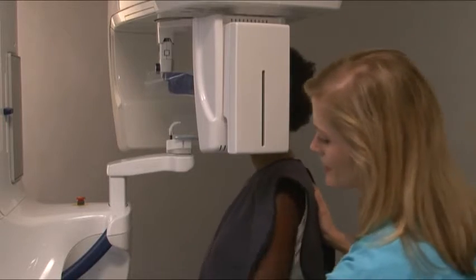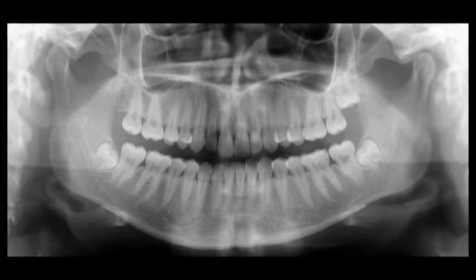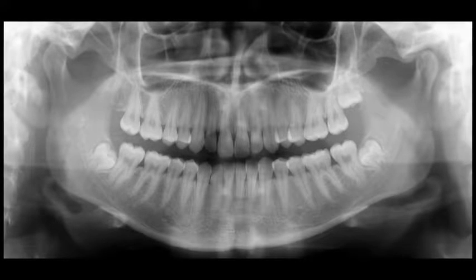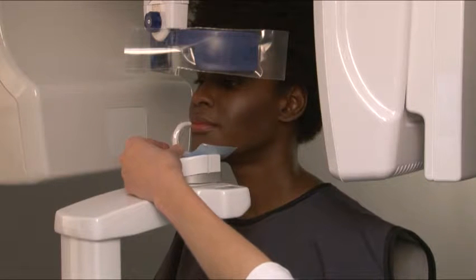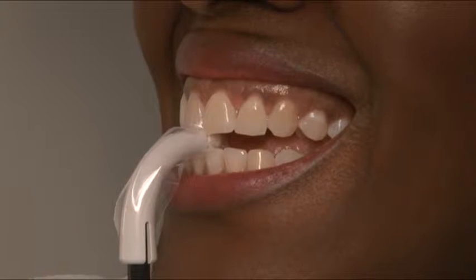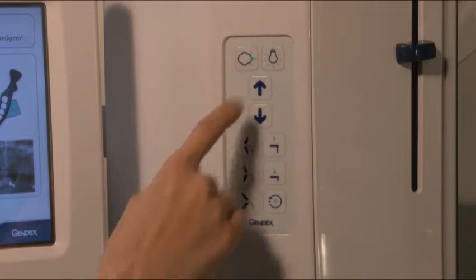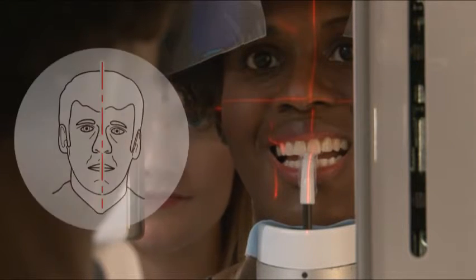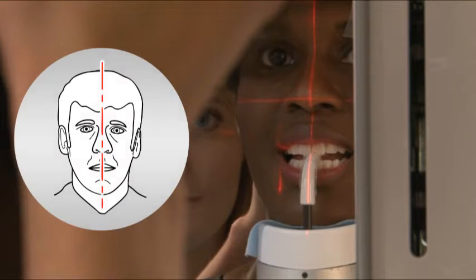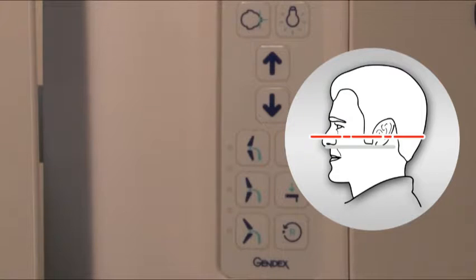Ask the patient to step into the unit and grab hold of the handles. Excellent image quality is a result of careful attention to positioning — good positioning equals good images. Ask the patient to rest his or her chin on the chin rest. For dentate patients, they should place upper and lower anterior teeth into the groove on the bite guide. Press the laser button to initiate the laser alignment lights.